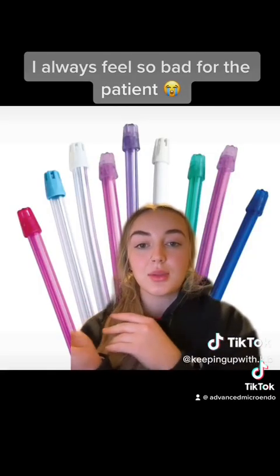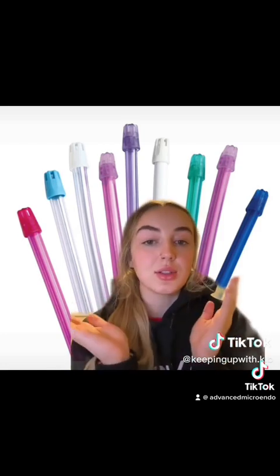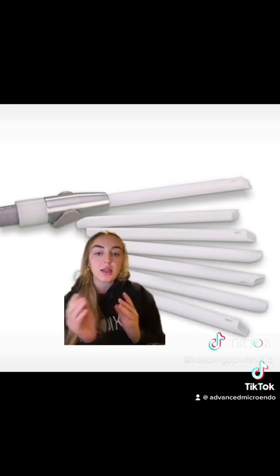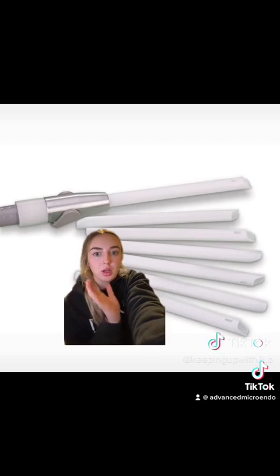A lot of times we'll say close like a straw. If you're getting a cleaning, this is also what's used. It's very tiny and you can close on it, obviously. This is an HVE. You can kind of see that it's just larger in diameter. It suctions a lot more, a lot quicker.